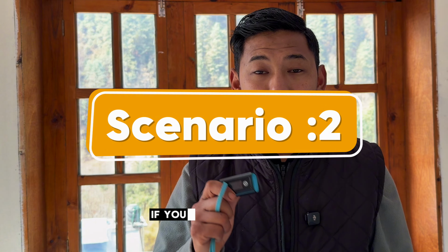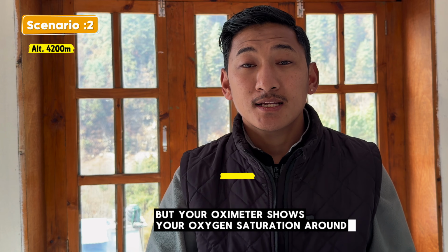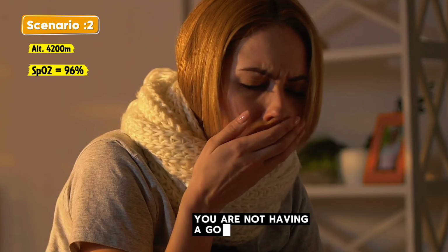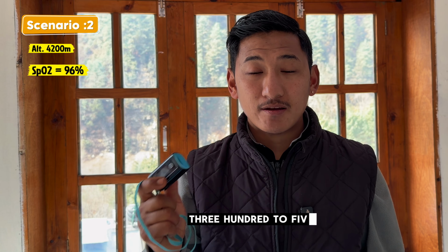Scenario two: if you are at the same elevation of 4,200 meters but your oximeter shows your oxygen saturation around 96, but your health condition is very bad, you have vomiting, nausea, you are not having a good appetite, then you should listen to your body and you should drop down immediately 300 to 500 meters.